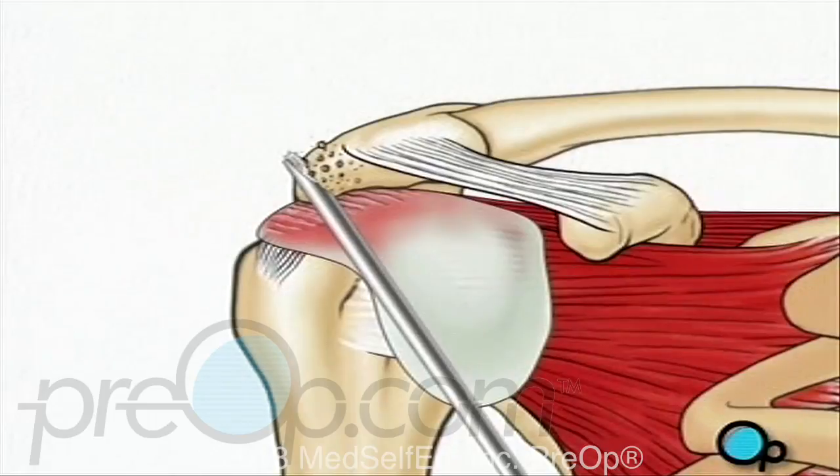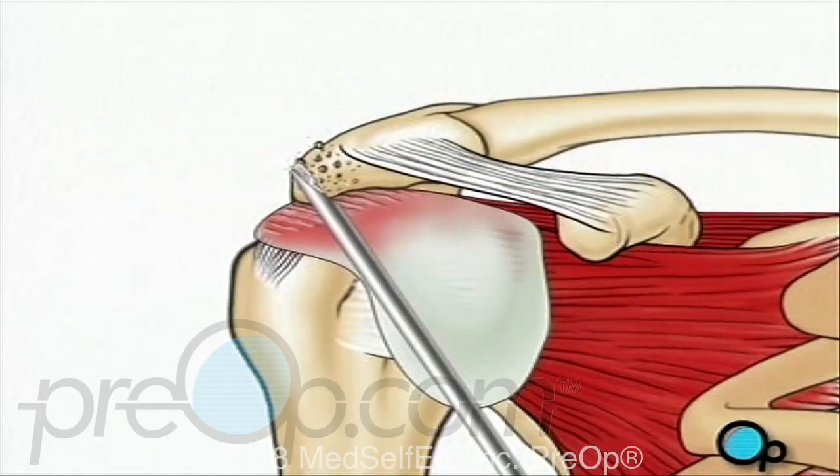First, your doctor will use a burr to file away any rough edges on the upper part of the shoulder bone, called the acromion.